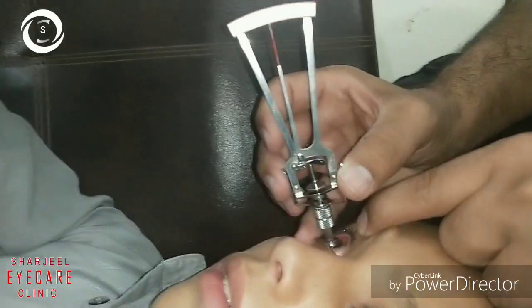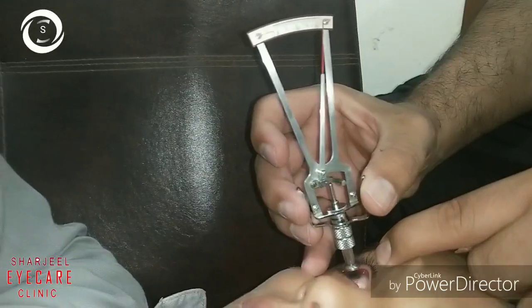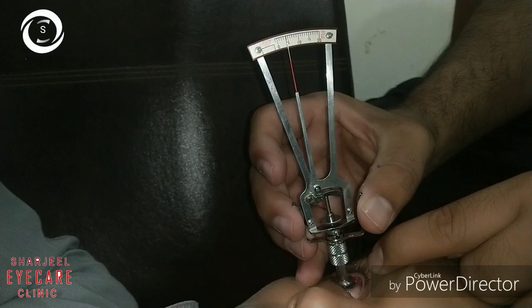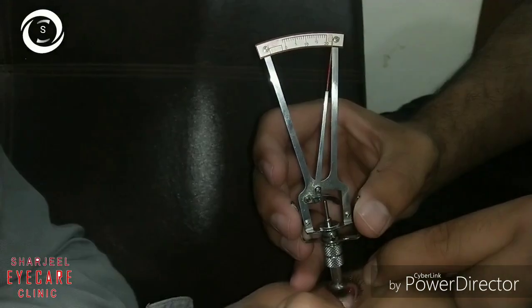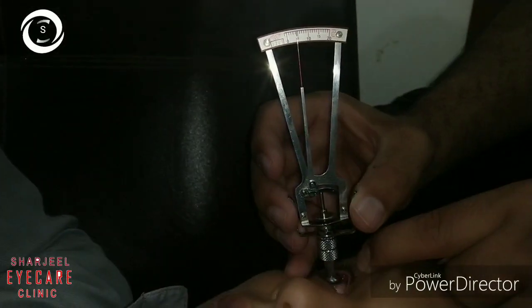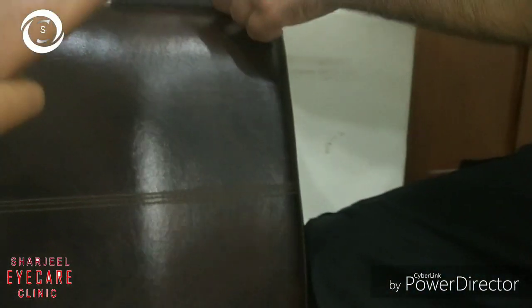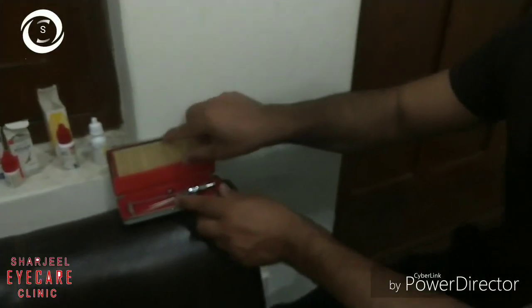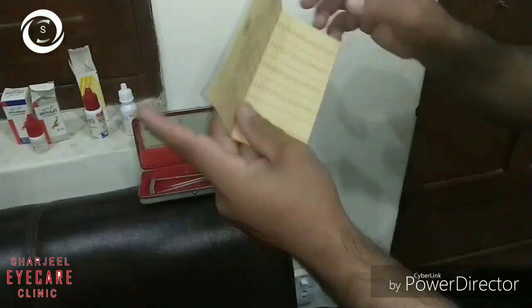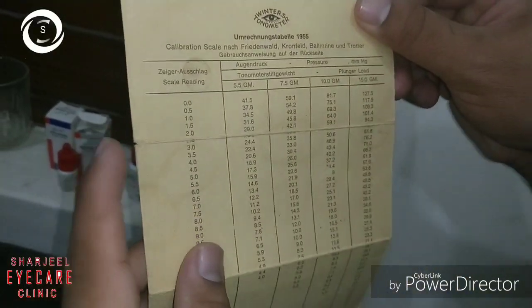This patient has not developed steroid-induced glaucoma, which is one of the common findings in vernal keratoconjunctivitis patients. With the 10-gram weight the reading was 11 and 12, and without weight the reading was five and six. When compared on the Schiotz calculation chart, the intraocular pressure was normal.